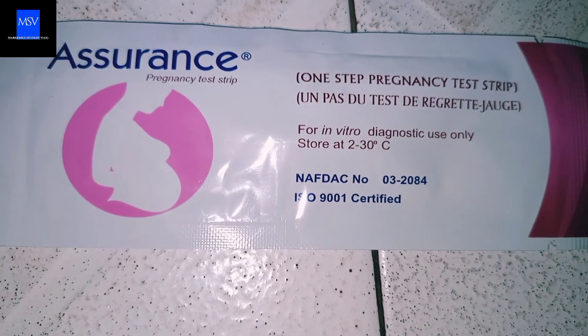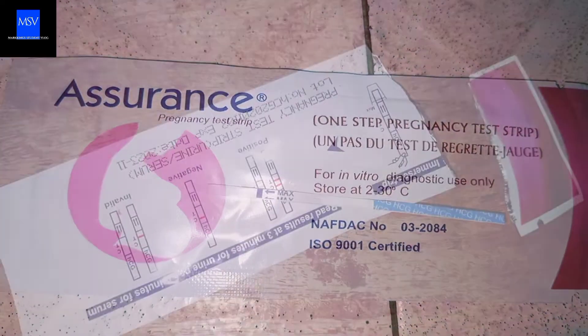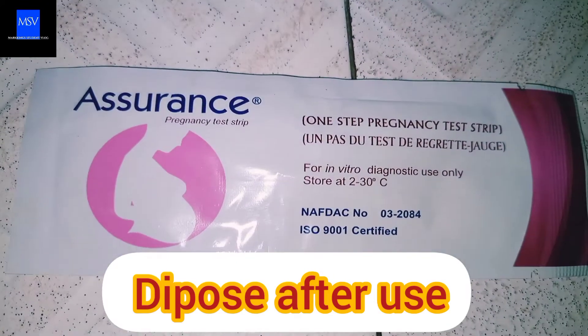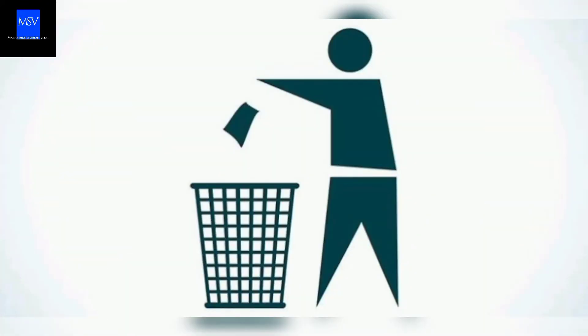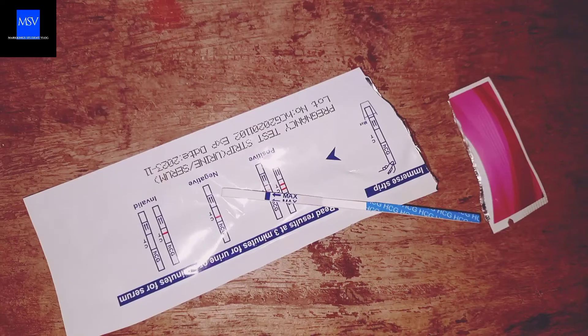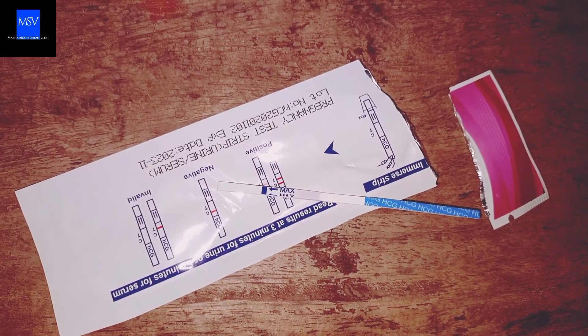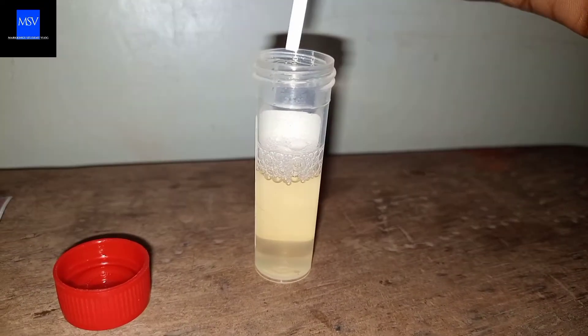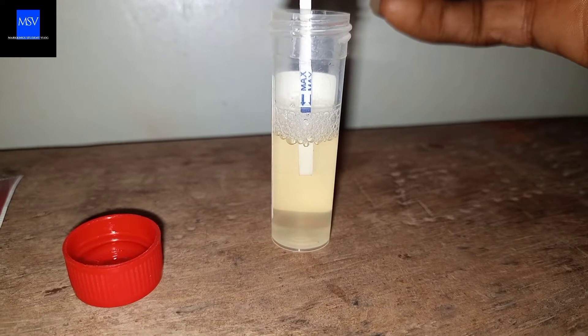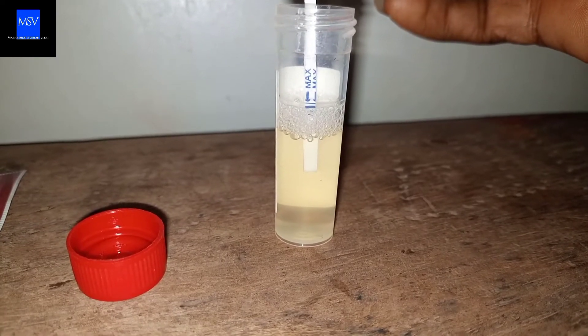Note: the Pregnancy Test Strip should be sealed and you should be the one to open it. Also, you can only use it once — you can't reuse it. Once you've gotten your patient urine sample and the strip ready, tear the seal of the strip and then dip the point where two arrows are drawn. While dipping it, be careful not to pass the tip of the arrow drawing, because that's the limit to how deep it can enter the sample.